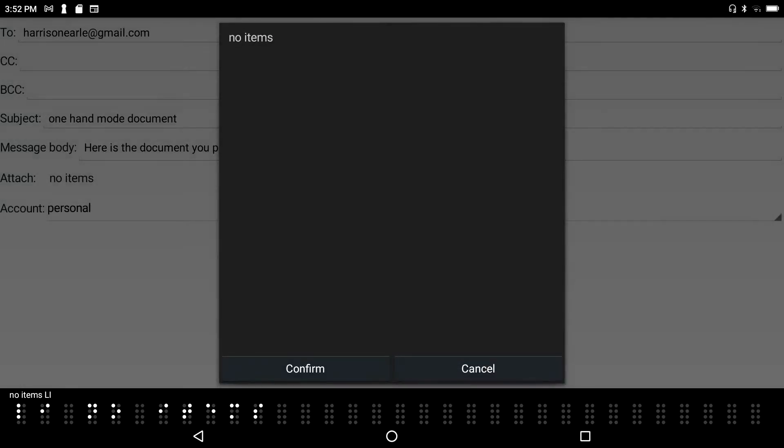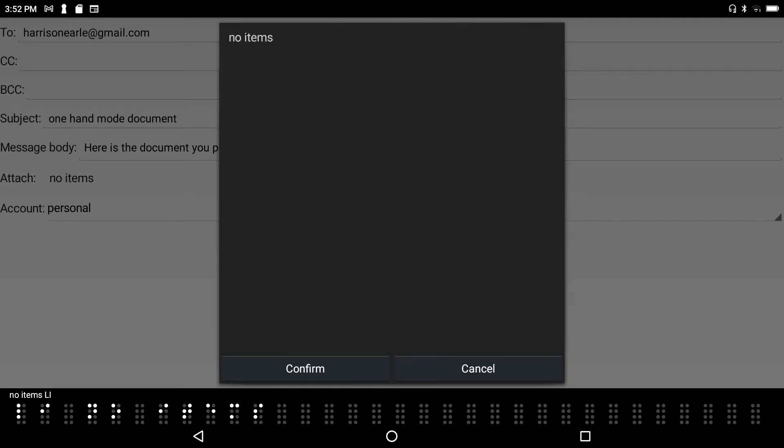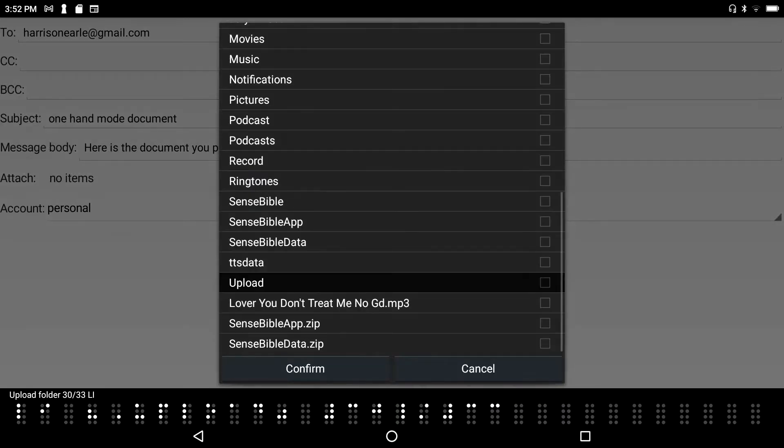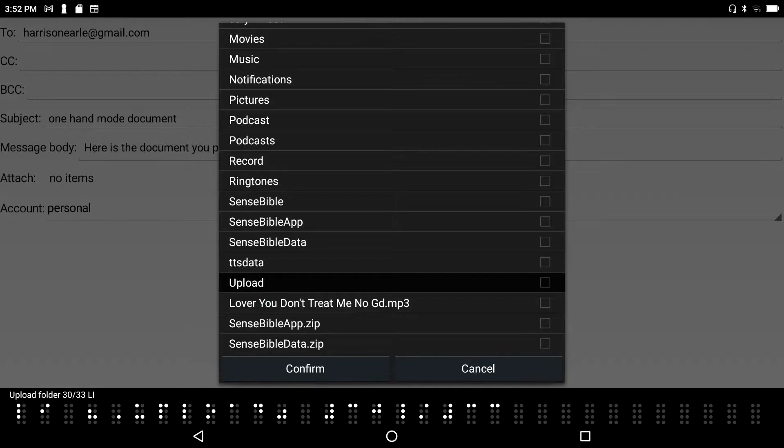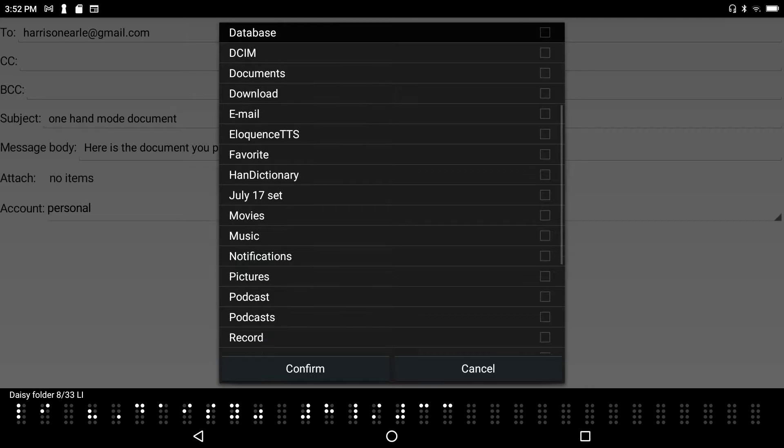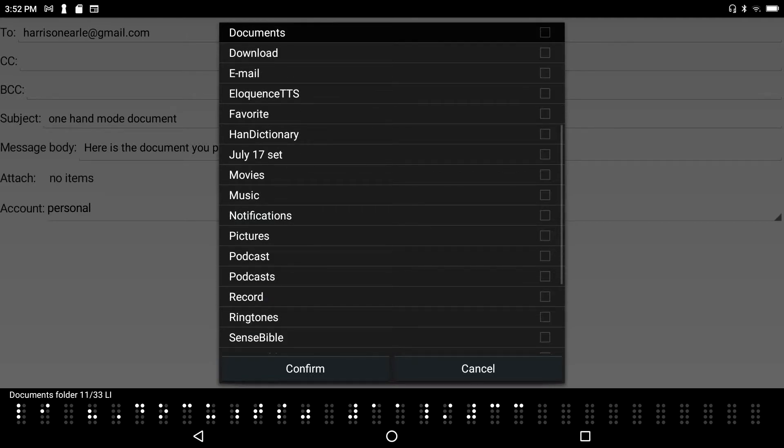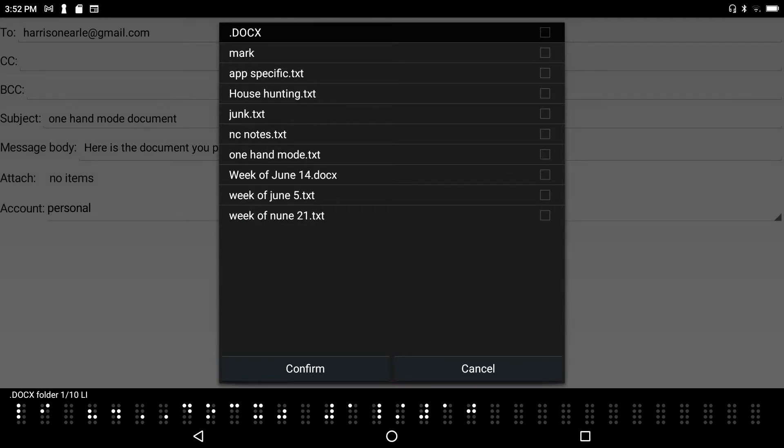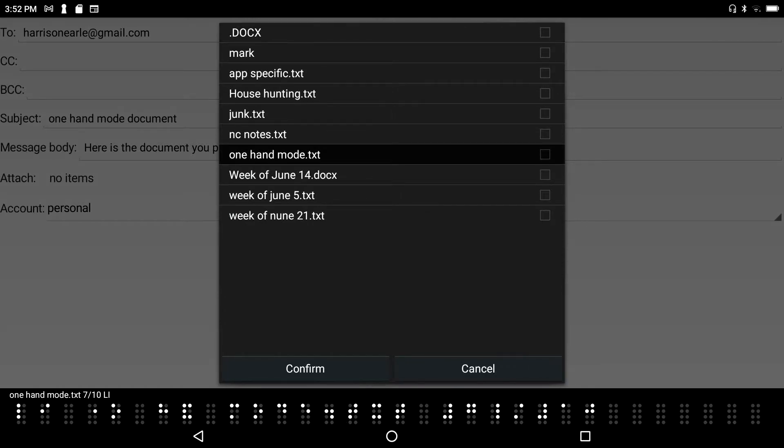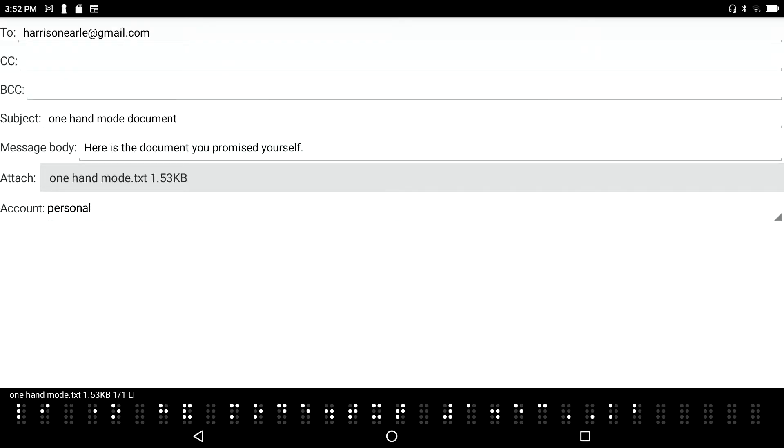I press enter on it and I hear no items in list. Well I happen to know that the default folder for reasons unknown is the upload folder so I'll press backspace to move up one level in this folder structure. I hear upload 30 of 33 in my case and I'm just going to go ahead and press D until I get to documents. That's also at the root level of my flash disk. I'll press enter on it, press the letter O and there's my one hand mode document. I'll press enter to attach it to my email message.